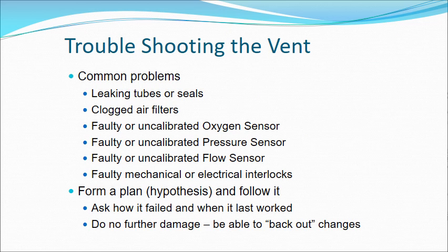Okay, well, hopefully your instructor stopped the slideshow and gave you time to do the previous exercise. If not, he should back it up and stop it and complete that exercise, and then we'll move on to just a very short description of troubleshooting the vent, because our main function for this seminar is to get you familiar with how to set up a vent, how to use it, not be afraid of it, and the troubleshooting is a whole other seminar because it's quite complicated. There's no way we're going to cover that in just a day.